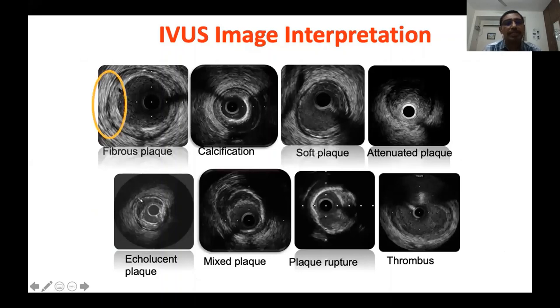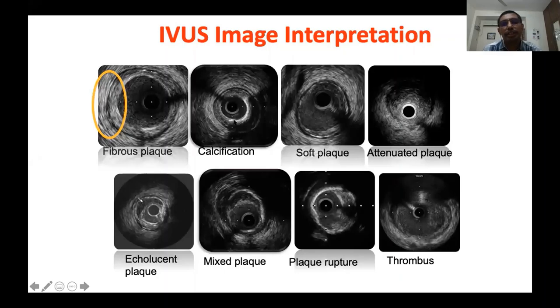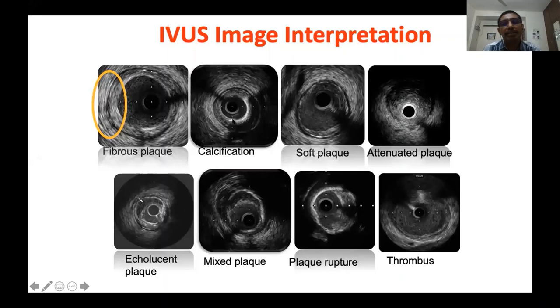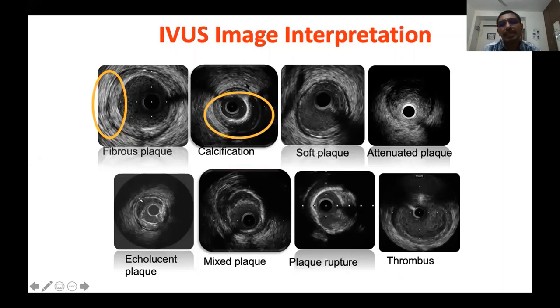Now starting image interpretation. Looking at echogenicity: here is your adventitia and here is your plaque — both have similar echogenicity — that is a fibrous plaque. Isoechoic equals fibrous plaque. Here you can see tissue that is hyperechoic compared to adventitia, with only the leading edge visible and deeper shadowing behind it, plus ghost artifacts — reverberations resulting from repeated reflections. These three features — hyperechoic compared to adventitia, dorsal shadowing, and reverberation — indicate a fibrocalcific plaque.